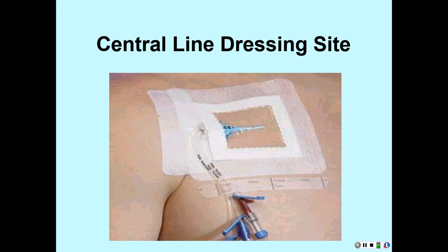So central lines, big infection risk. We've got to be aseptic. We're changing our tubing. We're changing our sites. Here they've got the tails, the pigtails kind of taped down.